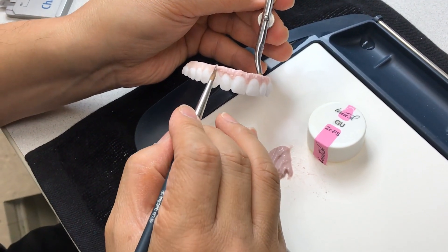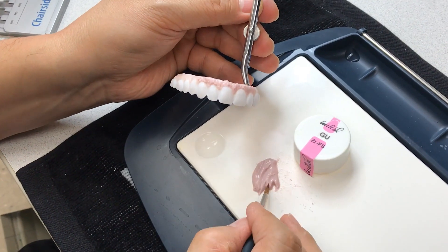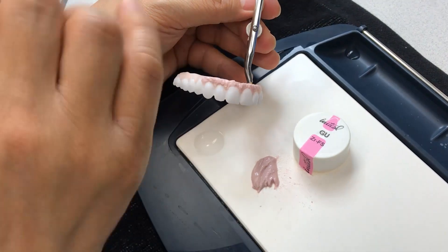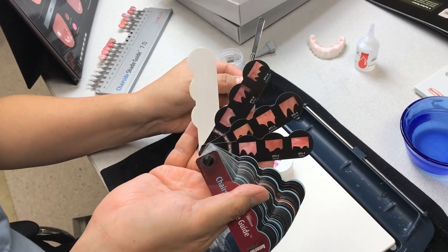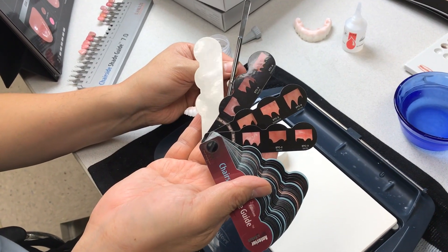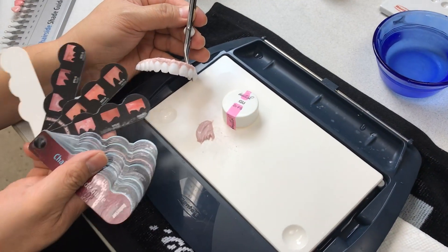How did you find out there were different shades of gum? Well, I got the photo from the doctor, or they can use our regular chairside shade guide — they can choose it. STC9, those kinds of things — they can choose, and I can mimic with that one.